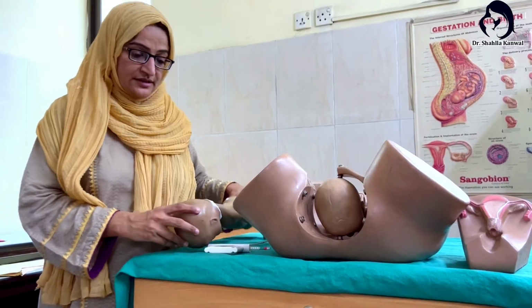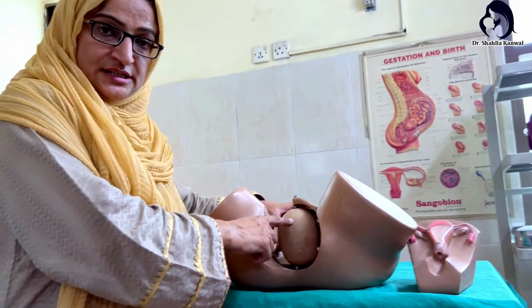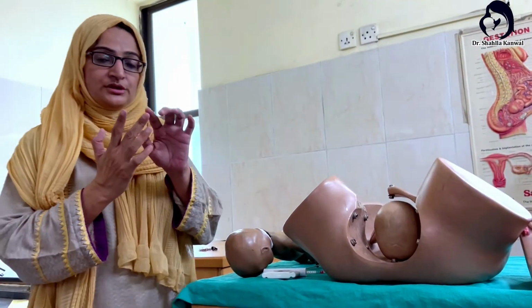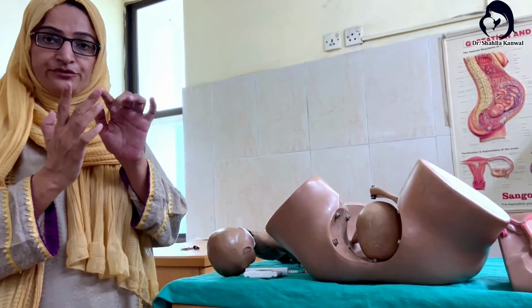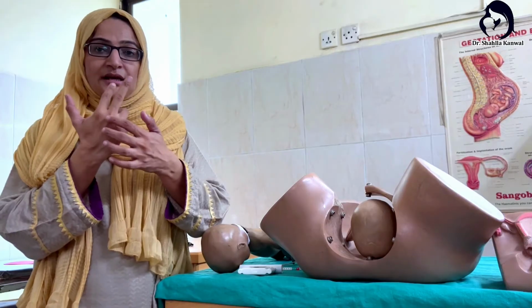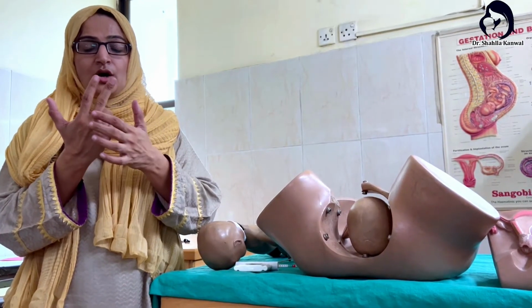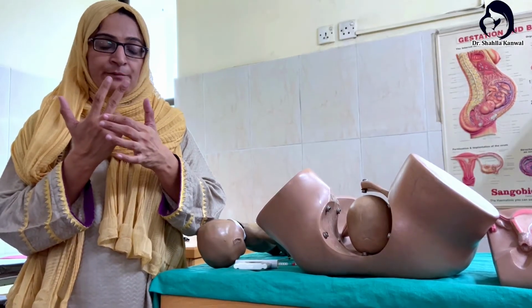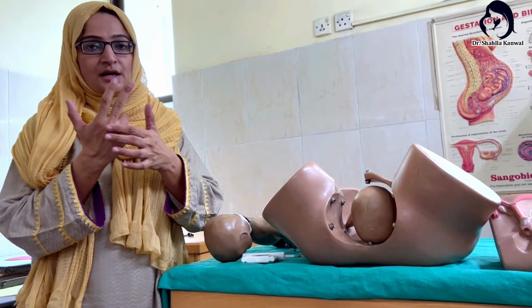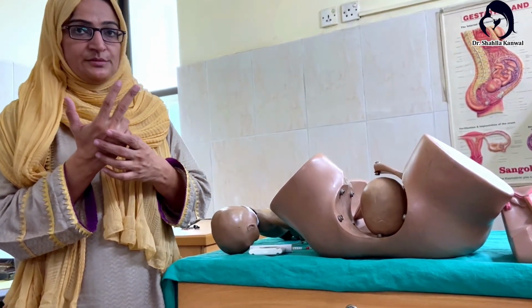After identification of this flexion point, you have to measure the insertion distance. The insertion distance can be measured when you know the length of your middle finger from the tip of the middle finger up till the proximal interphalangeal joint as well as the metacarpophalangeal joint. The normal distance from tip of the middle finger to the proximal interphalangeal joint is around 5 to 6 cm, but up till the metacarpophalangeal joint, it is around 10 to 11 cm.